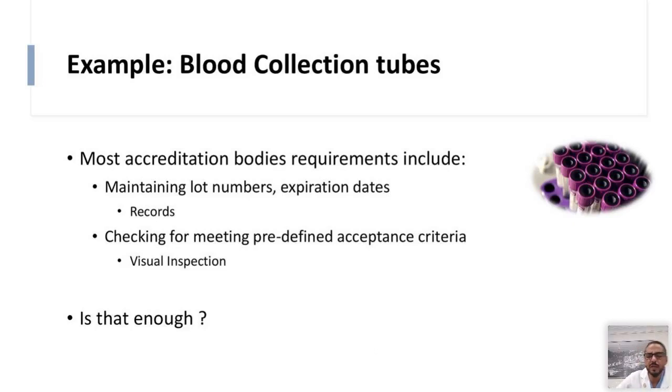Let's look at a very basic lab supply, the one we deal with in each and every laboratory: blood collection tubes and blood collection sets.